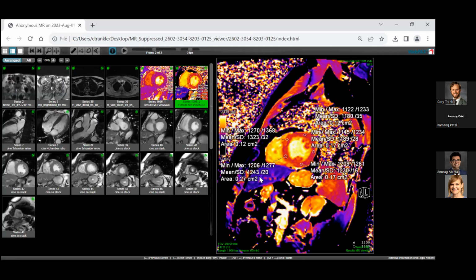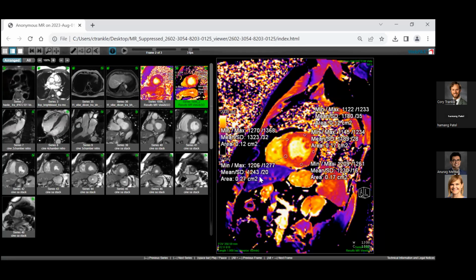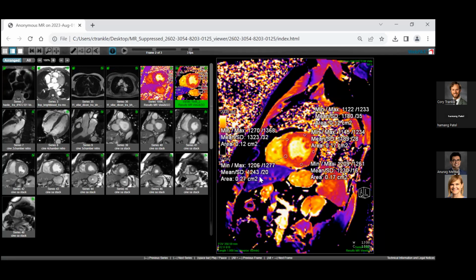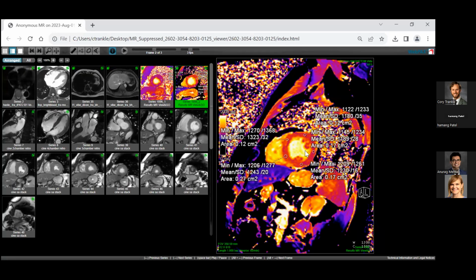What could that be? Fibrous tissue. It could be more fibrous tissue, replacement or reactive fibrosis. If you look here, there's a little thin start of white right there. See that bright color? That could be some fibrous tissue in there.